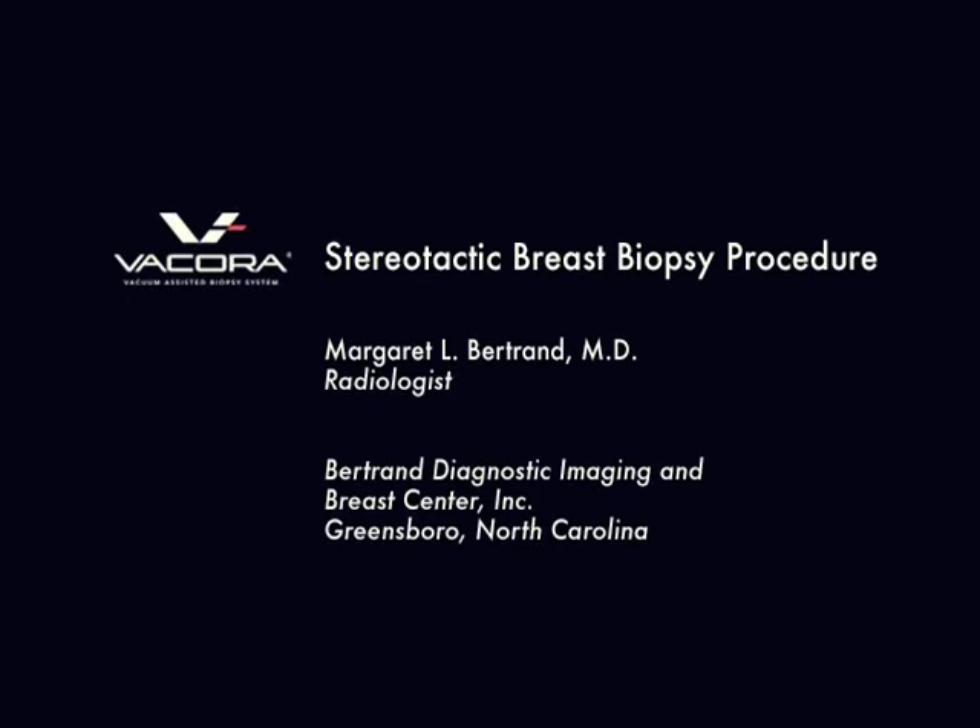The following procedure is a stereotactic x-ray image-guided breast biopsy using the Vacora Biopsy System. The procedure is being performed by Dr. Margaret Bertrand at the Bertrand Diagnostic Imaging and Breast Center.